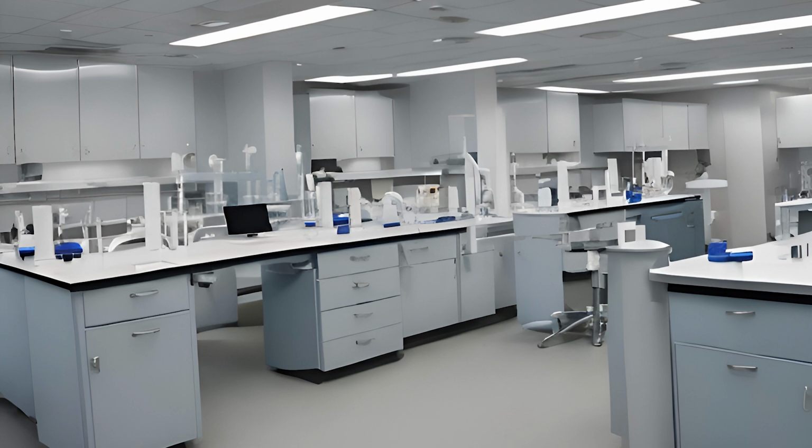Protect your patient from self-injury without completely restricting movement. You want to move them away from the metal structure. Phlebotomy chairs are often metal chairs. Move them away from the metal frame of that chair so they don't flail their arm out or their head and hit the chair or strike a hard object and injure themselves. And you want to time the seizure and notify first aid personnel.